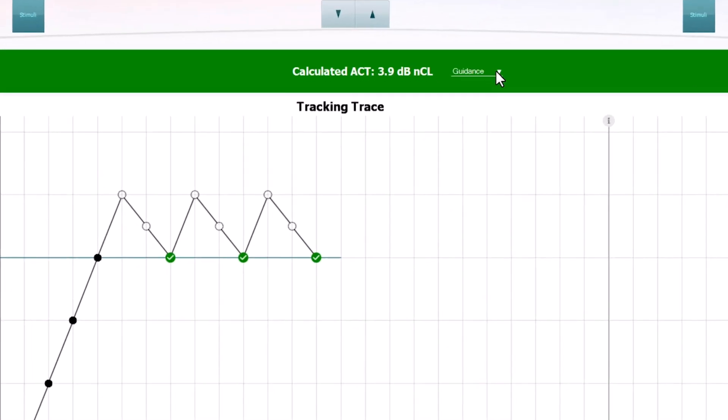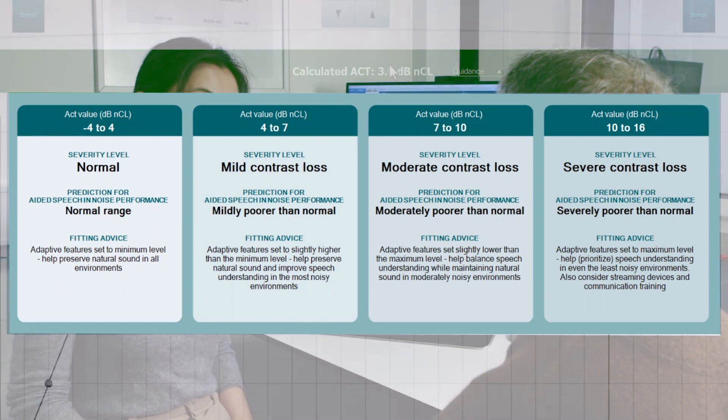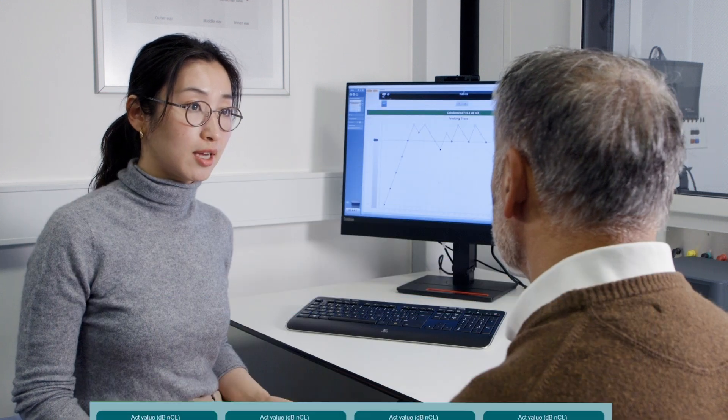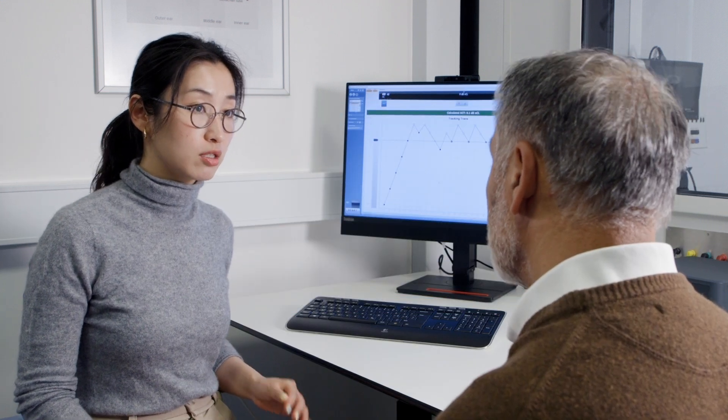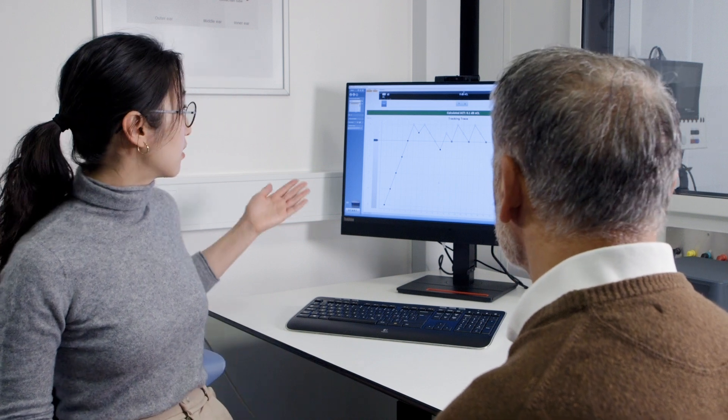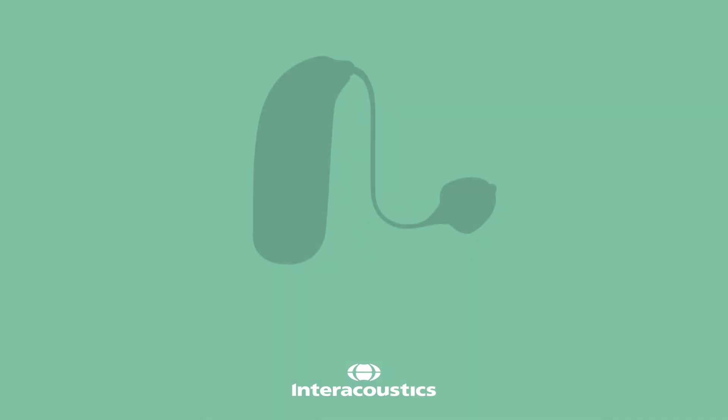Press on the Guidance tab to reveal our recommendations for the different ACT severity levels. Use this for counseling, to adjust hearing aids, to recommend assistive devices, and to discuss rehabilitation and communication strategies.